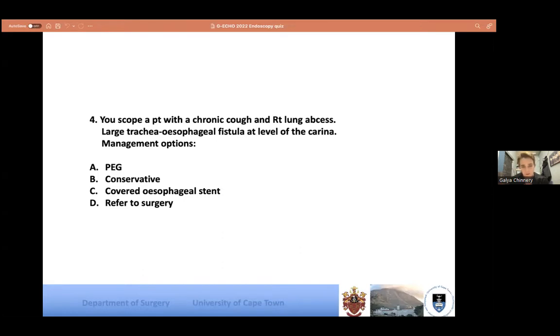There's no stricture. You flew down that esophagus. That stent will have moved by the time the patient is back in the ward. You would need to find a way to keep that stent in place. You can use an Ovesco clip potentially. Hemoclips don't work. The mucosa just falls off after a while, so that doesn't work. So I think a stent is not an option.